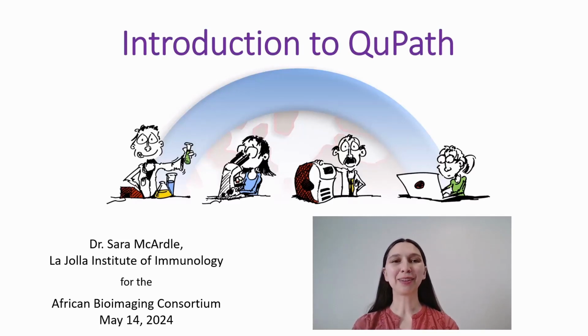Hello, thank you for having me here and for giving me a chance to talk about one of my absolute favorite image analysis programs, QuPath. I've been using QuPath since around 2018, and I think it's one of the most powerful, versatile platforms for image analysis I've ever used.